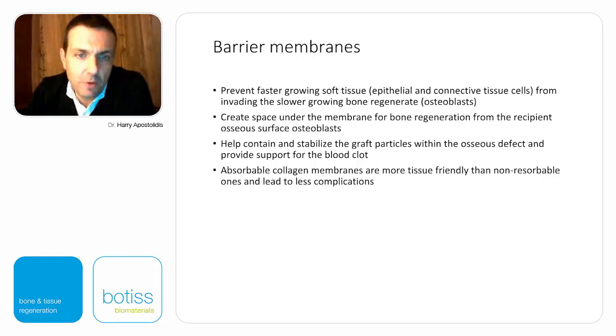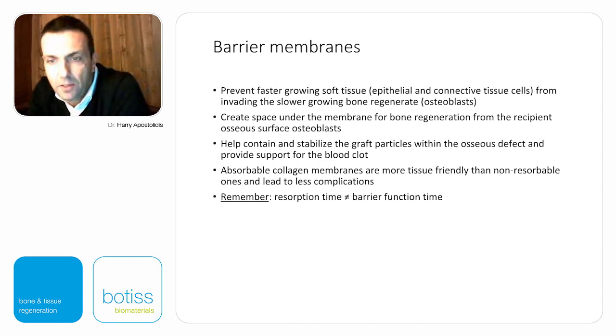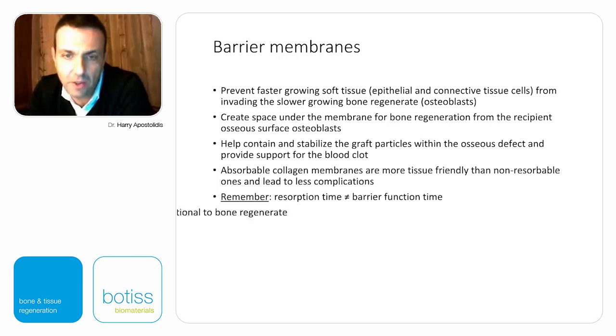We all know that the absorbable collagen membranes are more tissue friendly than the non-resorbable ones and lead to fewer complications. But remember, resorption time is not the same as barrier function time. If a manufacturer tells you that the resorption time of the membrane is 2 months or 3 months, remember that your barrier function time will be much less than that. So try to get a membrane that has a longer resorption time. You're going to have a longer barrier function time.